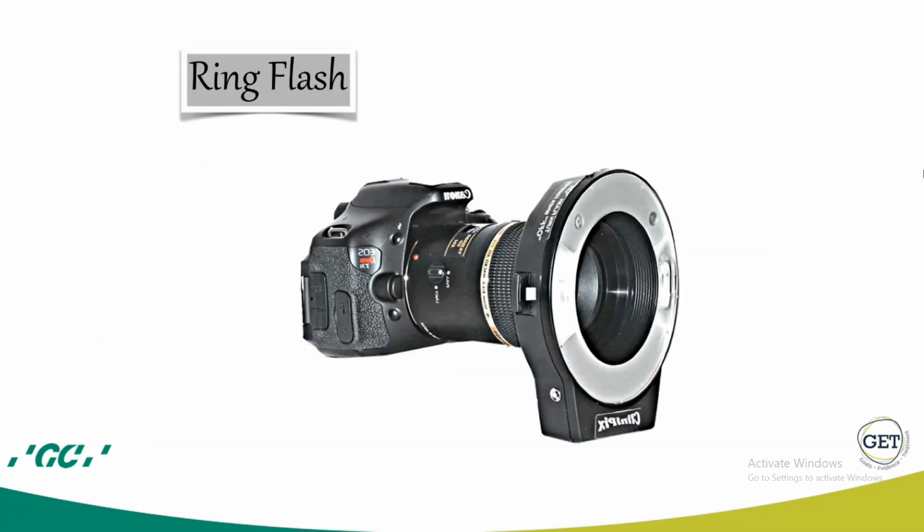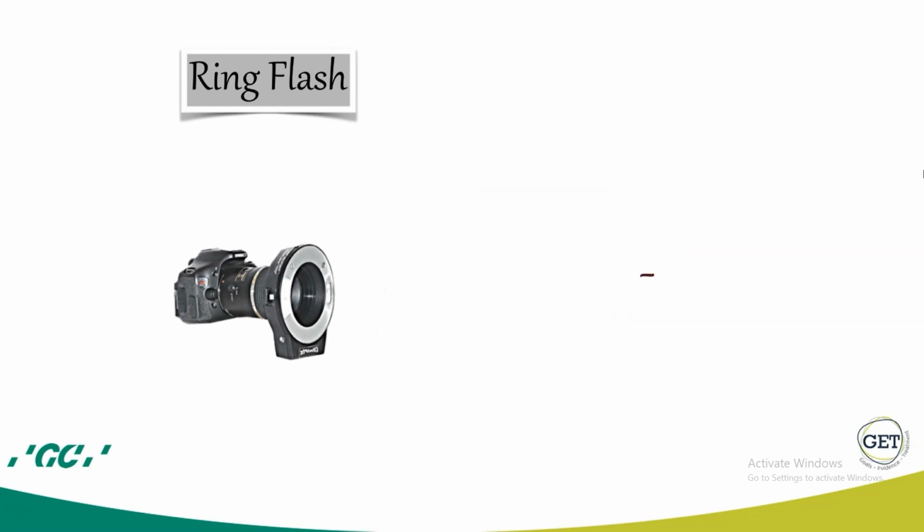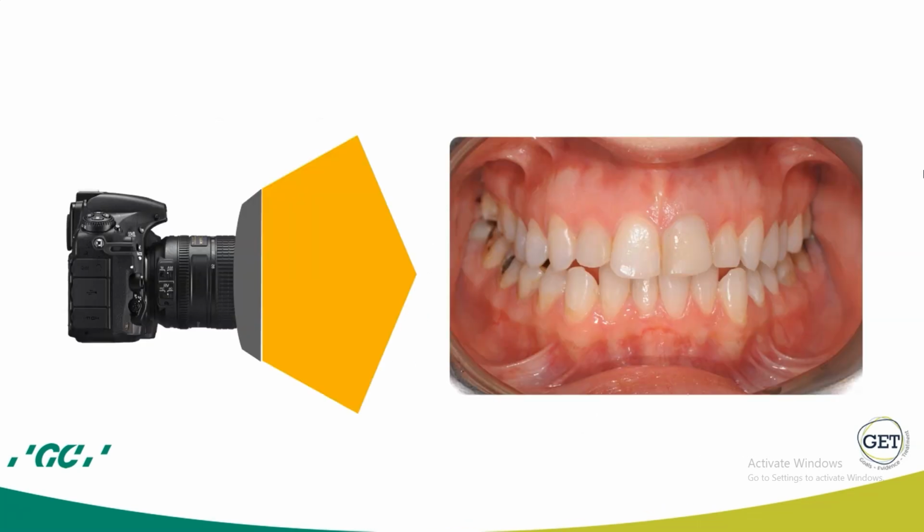Ring flash. It is the most popular intraoral flash in dental photography. It's good and cheap. It's easy to use. Good for orthodontic photographs. No shadows at all, which makes your photographs look two-dimensional. Here is a light direction of a ring flash.